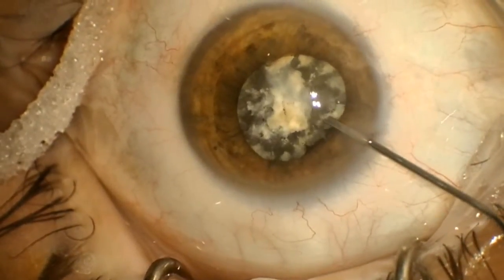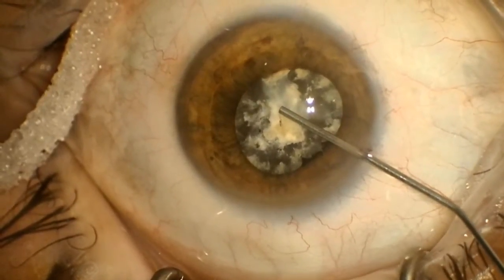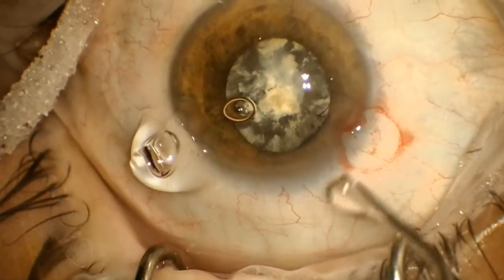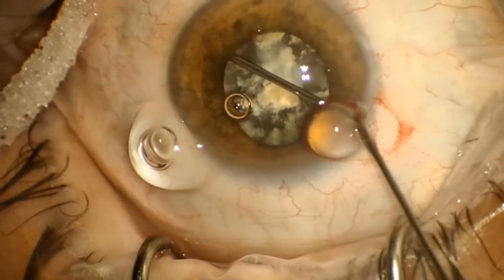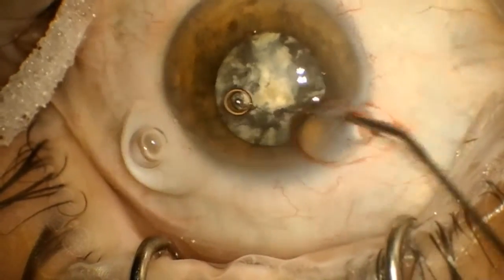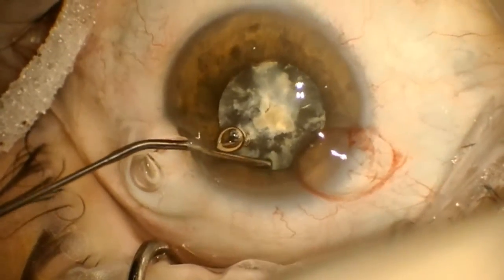Viscoelastic is used to break most of the adhesions between the iris and the lens capsule. Once all the posterior synechiae have been ruptured, the pupil is ready for the iris expansion device.